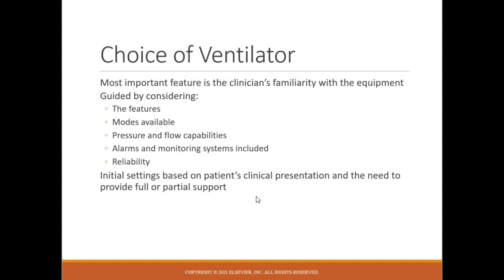So picking the type of ventilator really doesn't matter that much in the grand scheme of things. I think probably with your experiences at clinicals of seeing these different ventilators, they all kind of do the same thing. You're all going to have your favorites, but they essentially are all serving the same function. I really truly believe that the best ventilator is always going to be the ventilator that your staff is most comfortable with. So I'm a big proponent of not rocking the boat.